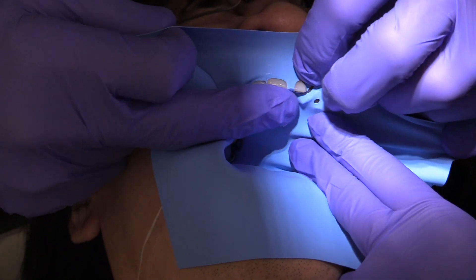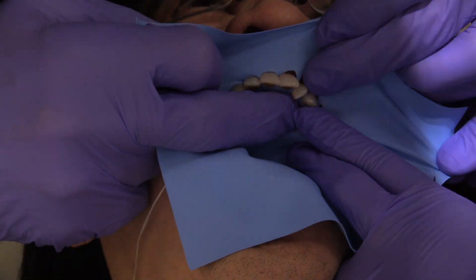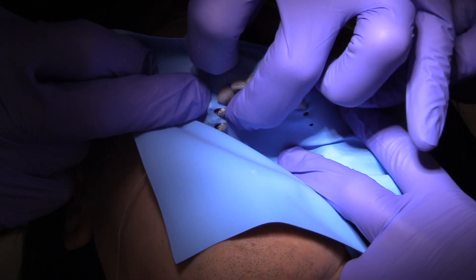I'll be placing the rubber dam from tooth number three all the way over to tooth number 13 today. I like doing this particularly when I'm working on a quadrant because it gives me great access to the area that I'm working.